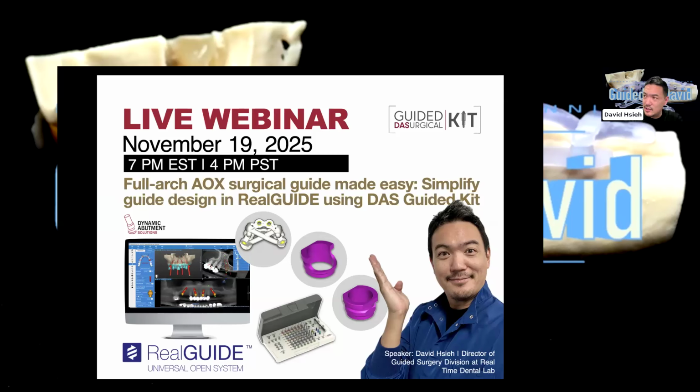There's so many implants, different abutments, and different criteria and needs that have to be fulfilled in order to proceed, right? Not to mention making the guide for that is, oh my God, this is so hard.